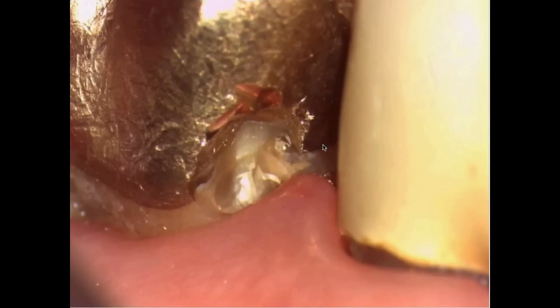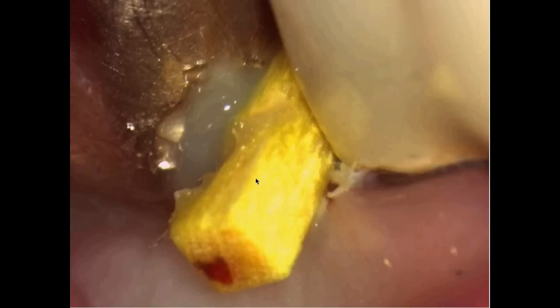How would you treat a caries like this? This is the lower 7, mesial aspect. It's a small cavity, but it's in a very critical area on the tooth, and you can see here is still caries. I couldn't detect that with my probe, but with a microscope it was easy to see, and so I could treat it properly. As you can imagine, it's almost impossible to place a rubber dam here. So I fixed it with a wooden wedge. The word is lacking for the moment. But I was able to see that the cavity was dry, and I could condition it properly and fill it, and I'm sure that will last for many years as well.